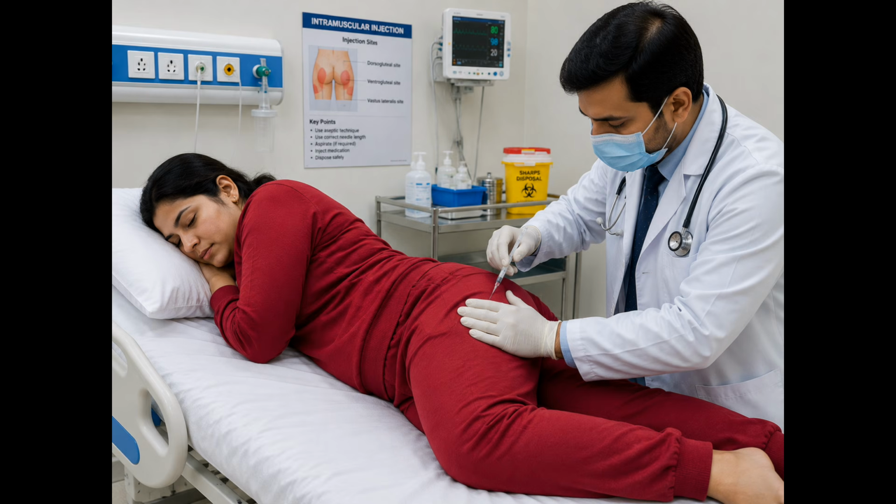Healthcare professionals choose the appropriate IM injection site using accepted anatomical landmarks and current clinical guidelines. Site selection depends on several factors, including the patient's age, muscle development, body size, medication characteristics, and healthcare facility protocols. Students develop these assessment skills through classroom instruction, simulation laboratories, and supervised clinical experience.